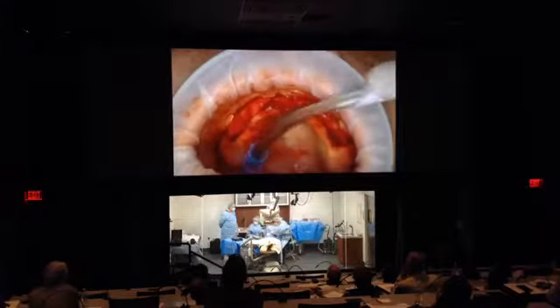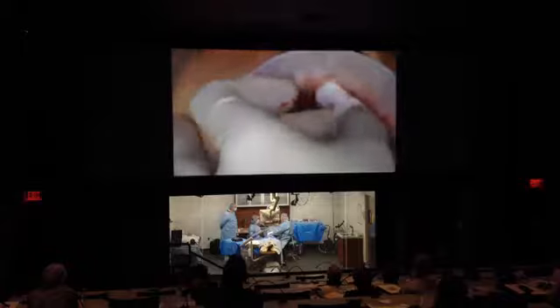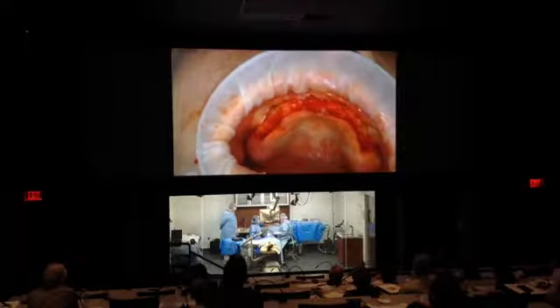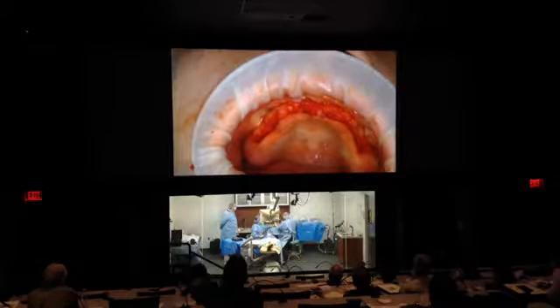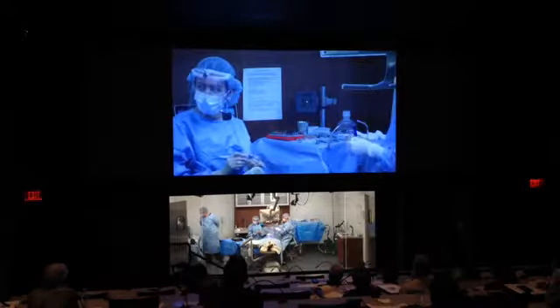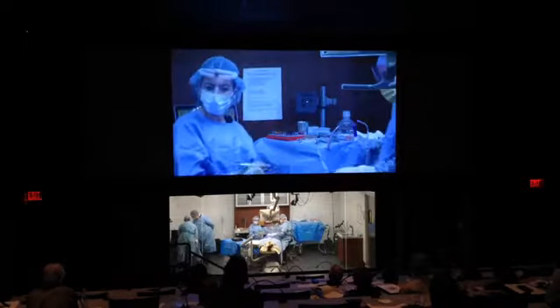We're going to prepare to place the All-on-4 guide. Is this ready to go? Okay. The All-on-4 guide, I was asking you for it earlier. You said it's in the water. Let me have the drill kit. Okay, let's try our, okay.